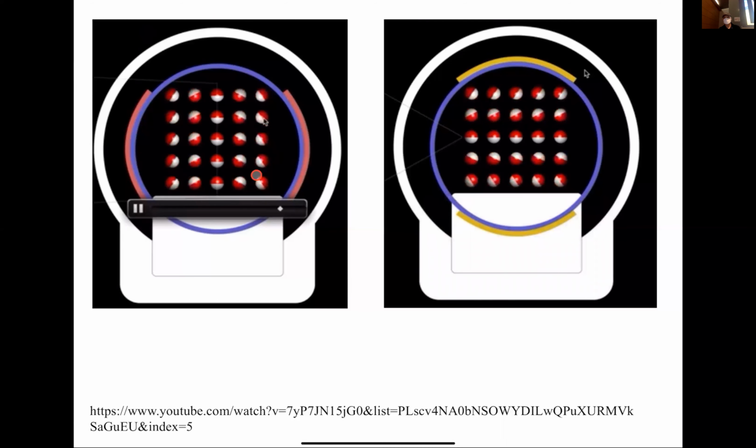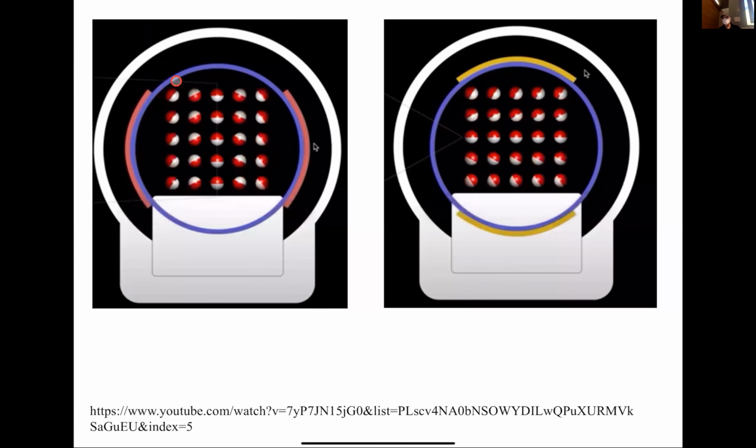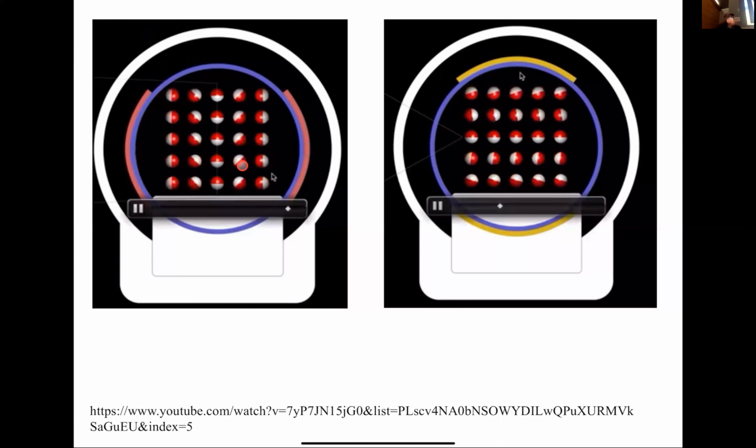Yes, these are the spins that are precessing faster. Just by looking at this movie, you can say the field here must be stronger than the field over here, because precession is clockwise. If something's going even more clockwise than your reference point, then it must be going faster.